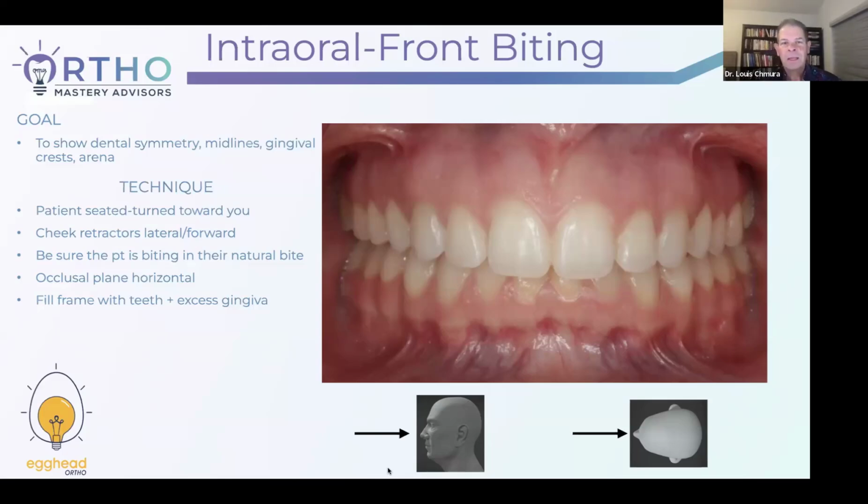So if they're laying in a dental chair and their head is straight up and they're looking at the ceiling, you're going to have a hard time taking good pictures, because normally most people are right-handed. They'll stand on the patient's right side, but it's very difficult to get the camera far enough over and actually see the screen to take the picture. What you want to do is just tilt the patient ever so slightly toward you. Then you can get the orientation proper.